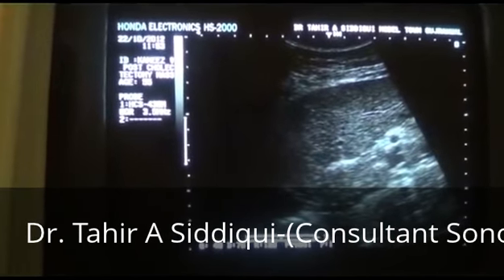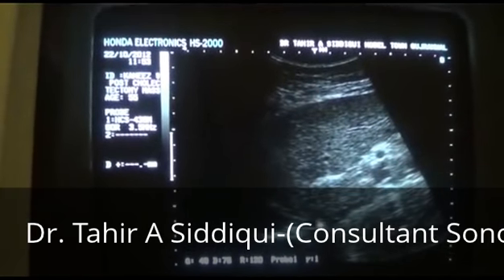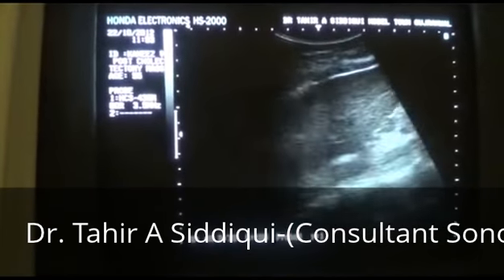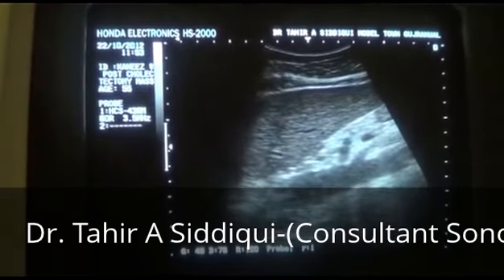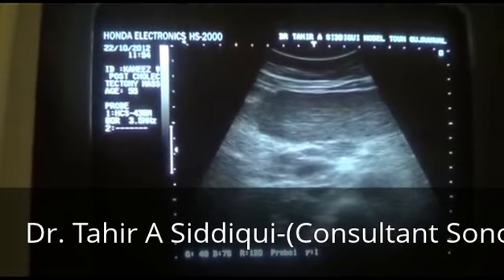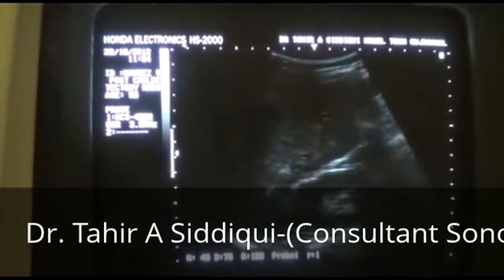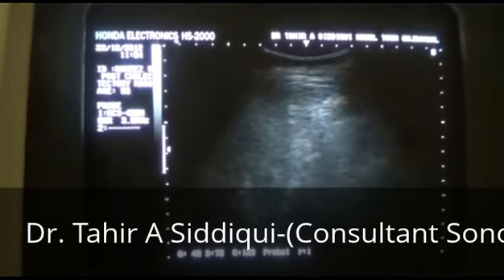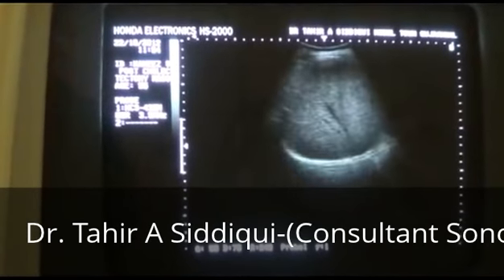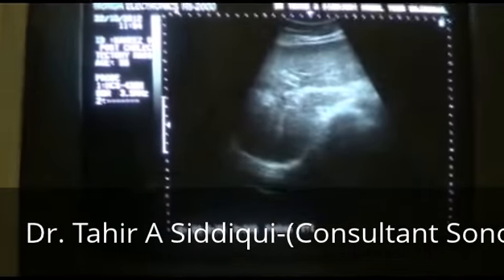Now, this is the left lobe of the liver, the ligamentum venosum, the IVC, and the caudate lobe of the liver. So, the masses that we see do not relate to the pancreas and/or to the kidney, as we saw, and not to the muscle, not to the liver as well. This is the total view of the liver.